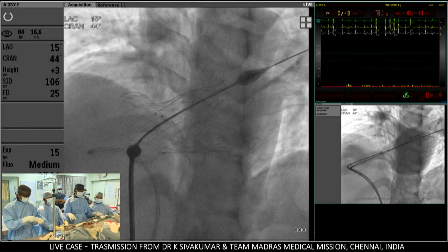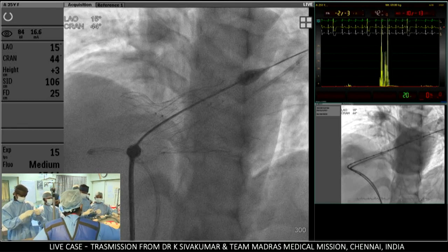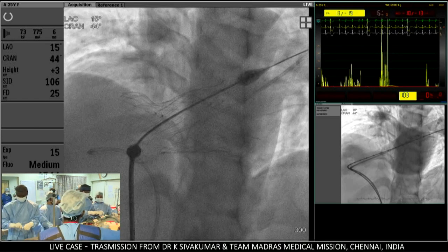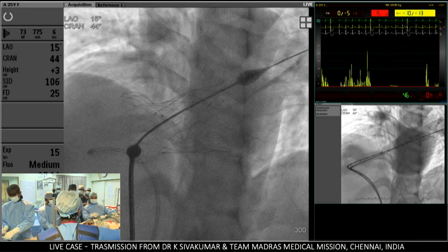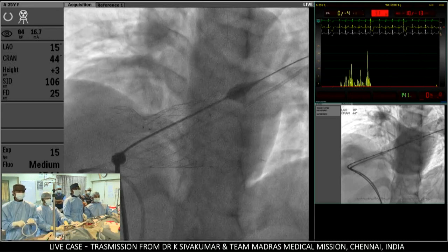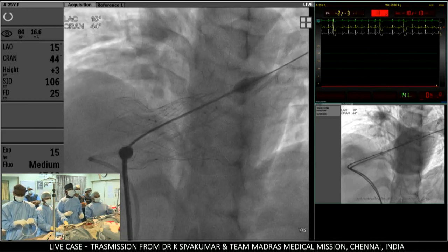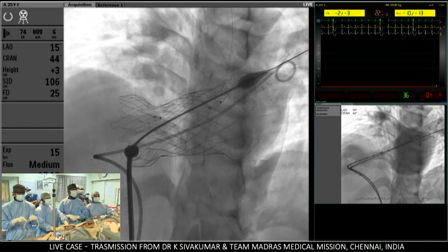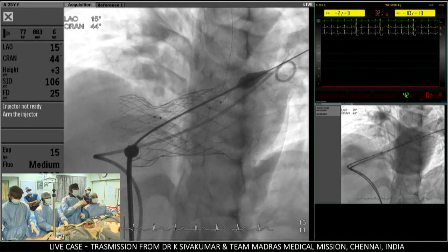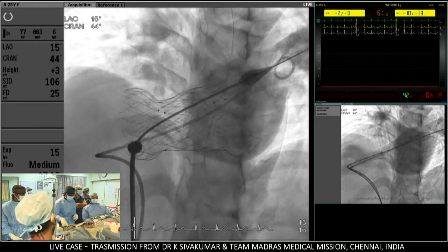Do you see, not being a venous operator, any challenges removing the carrot through this valve with that angle, or should it be pretty simple? I wish it goes simple, Alison. There were times at which there were some difficulties faced. Let me try it out. Now, what I'm going to do is make an angiogram of the distal part. Ready? The valve looks fine to me. Now, as Alison, you pointed out, the challenge is only to take out the carrot securely.